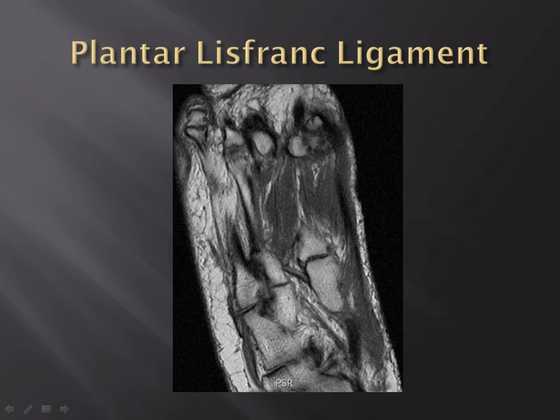Now, in the plantar aspect of the foot is a plantar Lisfranc ligament separate from the Lisfranc ligament proper. This extends from the medial cuneiform to the base of the third metatarsal, as opposed to the base of the second metatarsal from the Lisfranc ligament. But this is actually able to be seen on ultrasound as well.